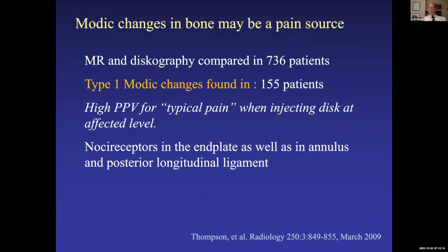Modic type 1 changes, meaning the marrow and end plate changes, may be associated with pain. This is a study by Thompson in Radiology in 2009, where he did discography. Discography, for those of you who don't know, is a provocative test where if you're not sure which level the patient's having pain from, you can inject the discs.